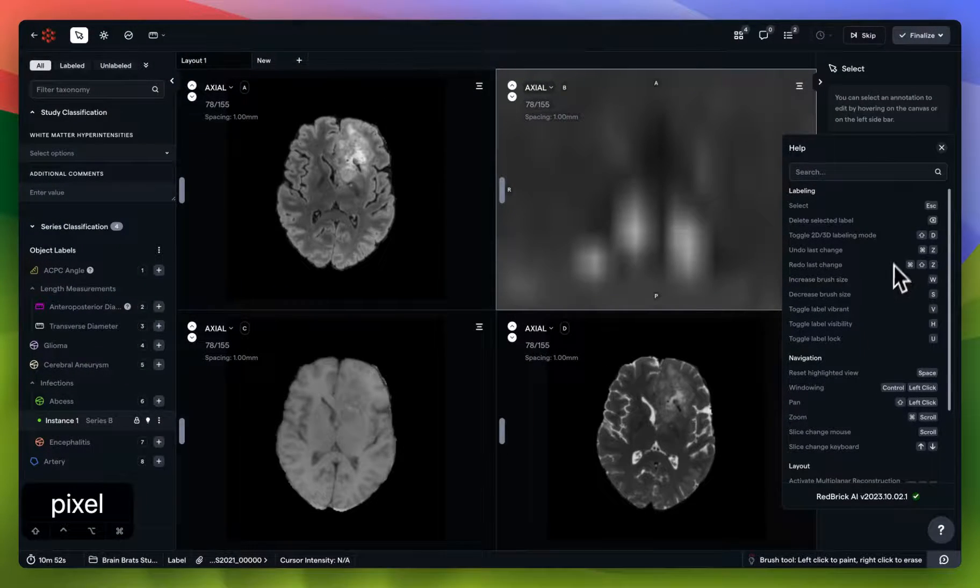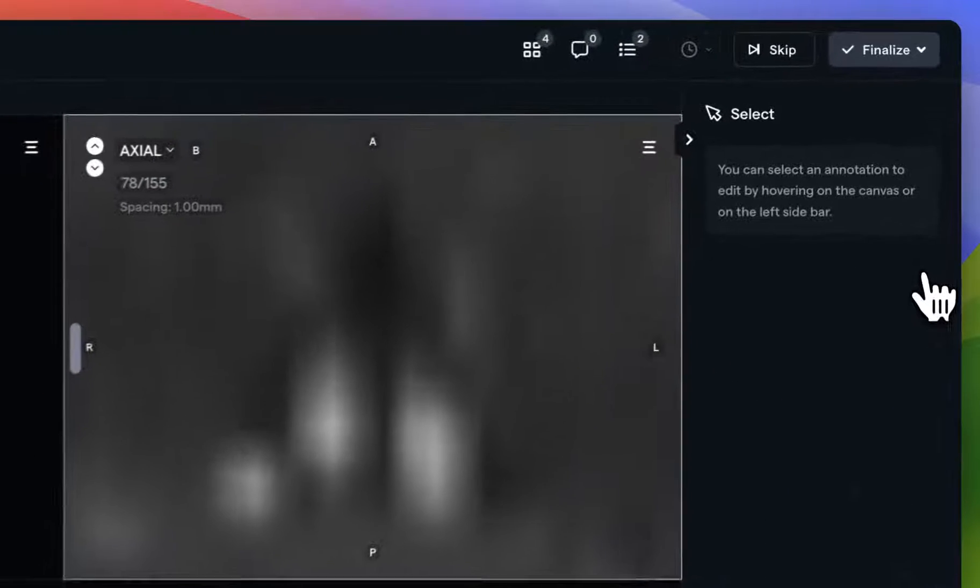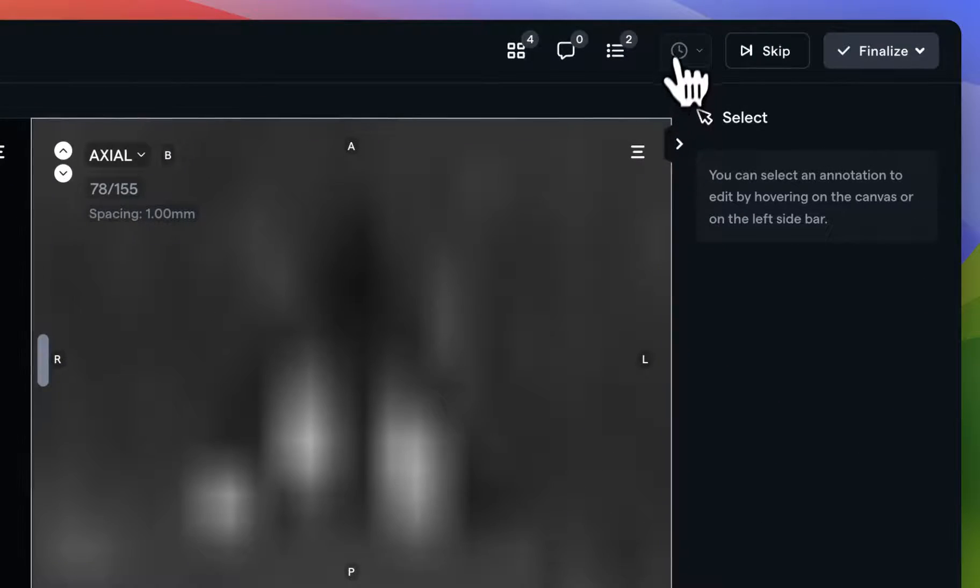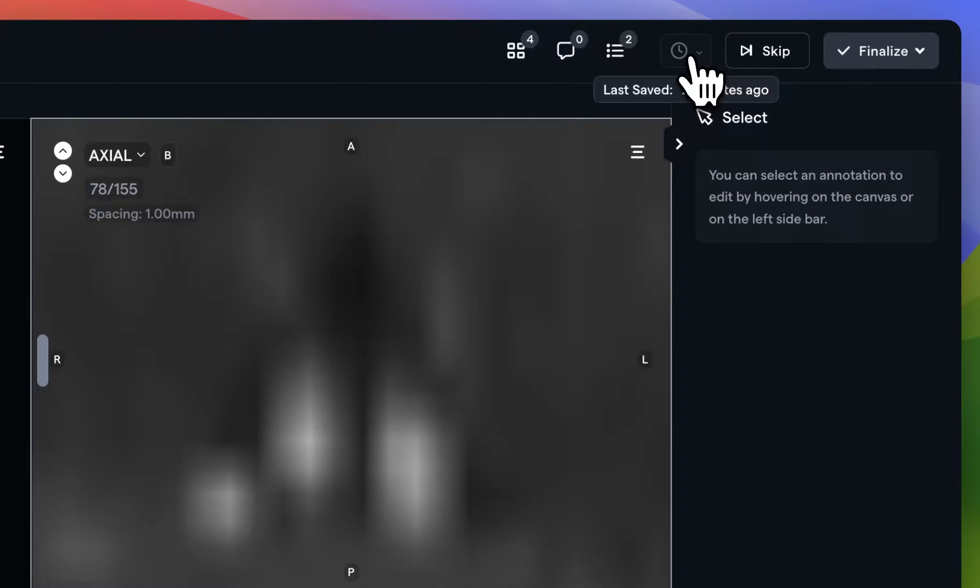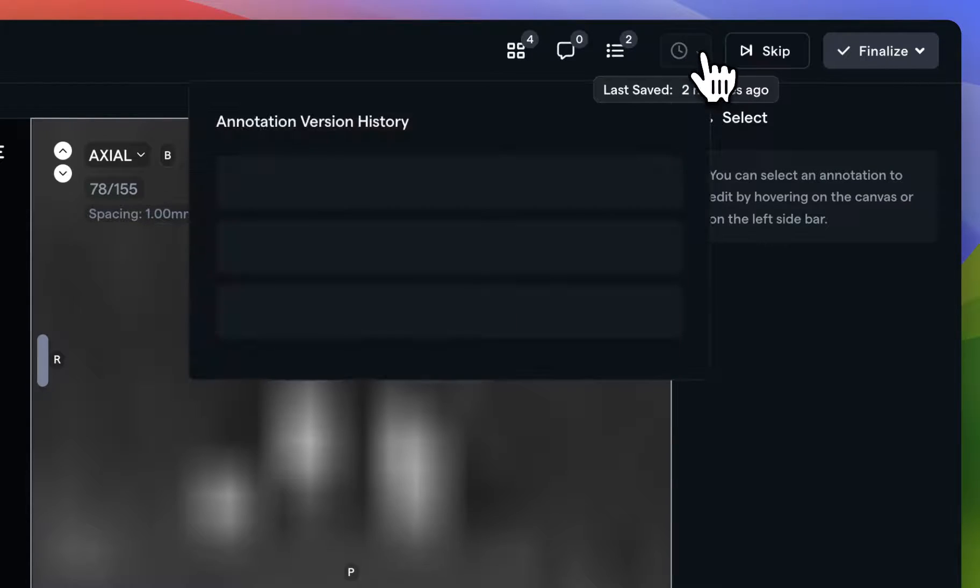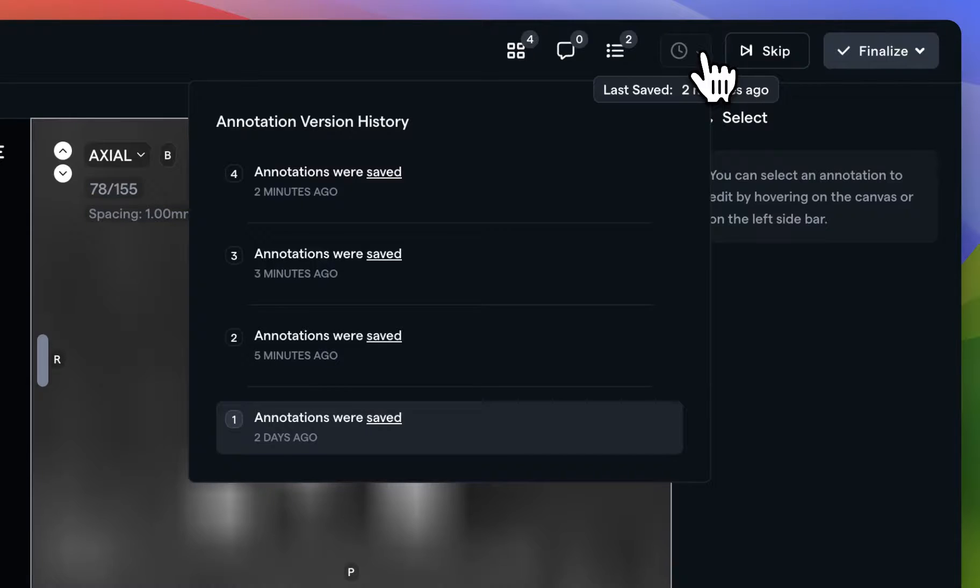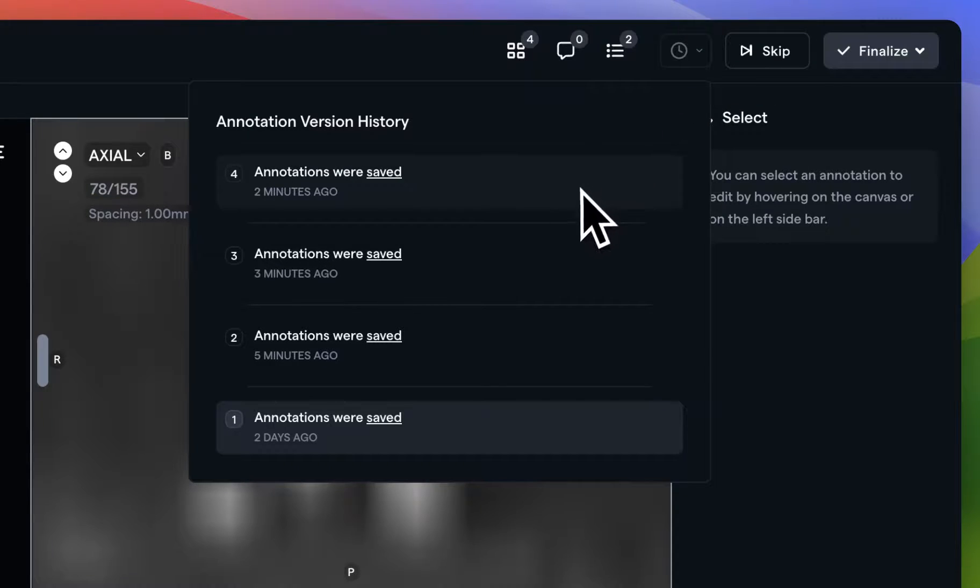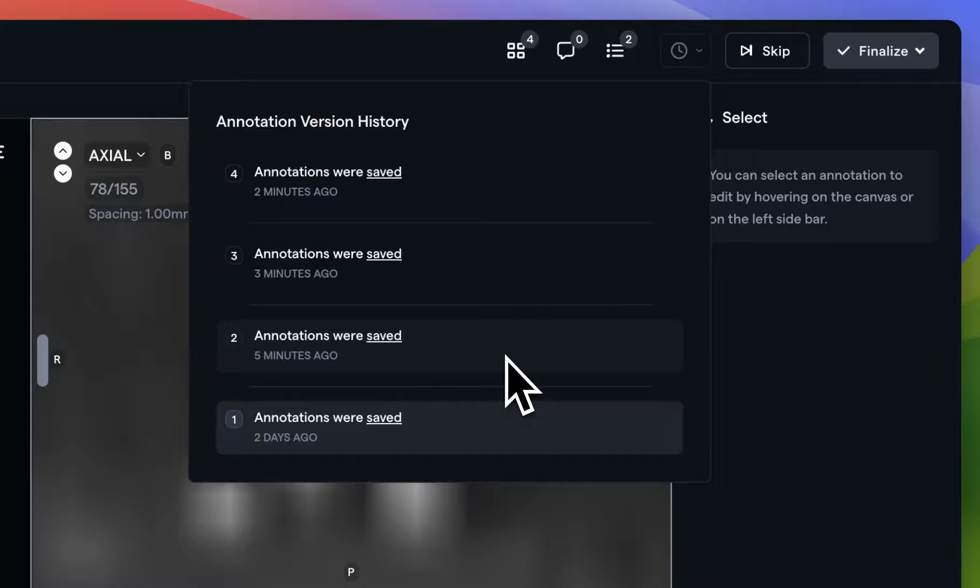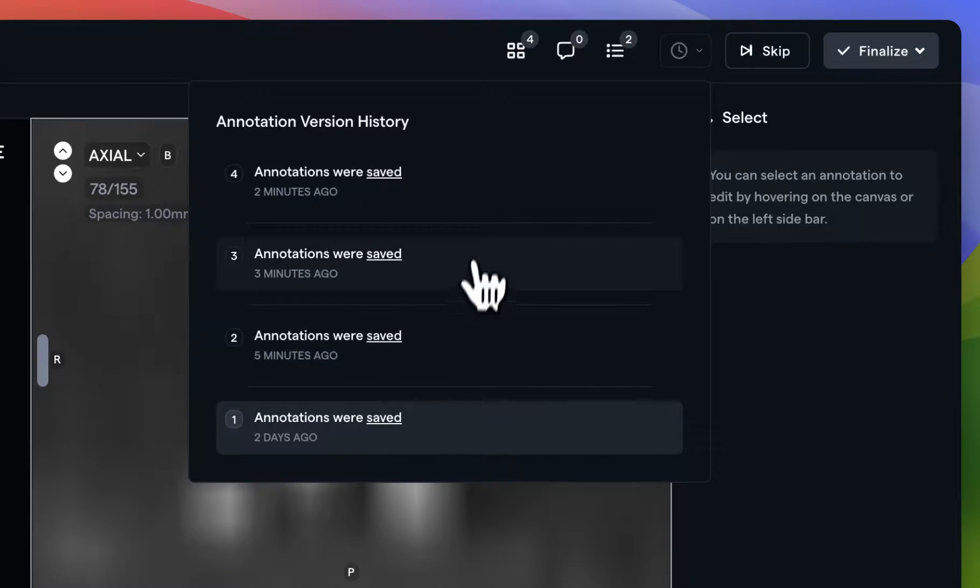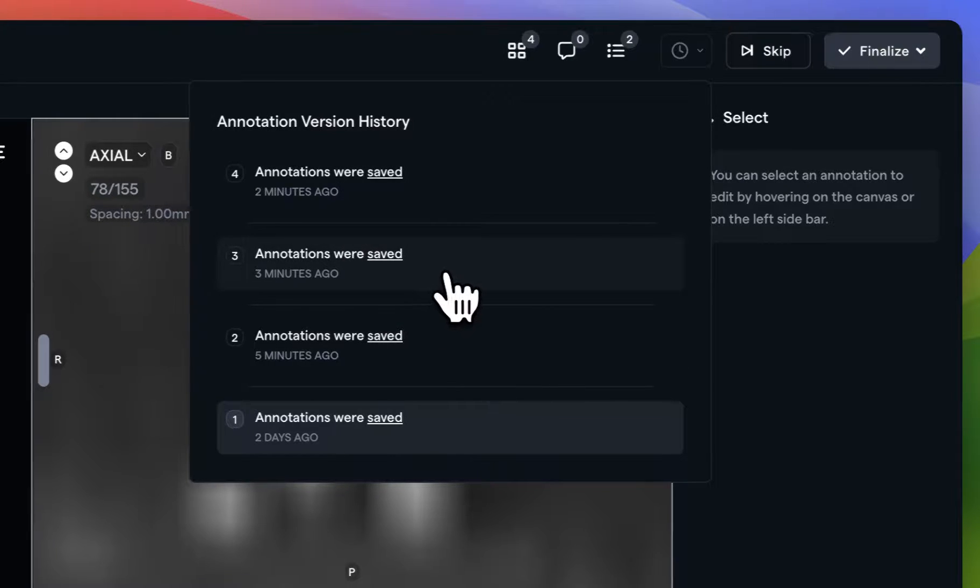Finally, we've come to the Save bar. Tasks can have several states within RedBrick AI, and which one you use depends on where you're at in your workflow. Every three minutes, you'll see that RedBrick saves by itself, but you can also manually save at any time.